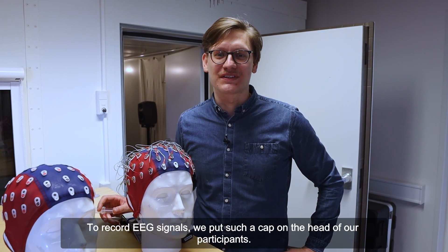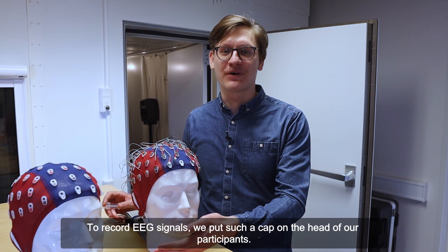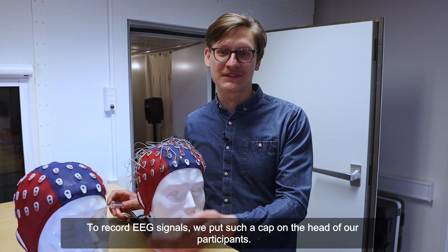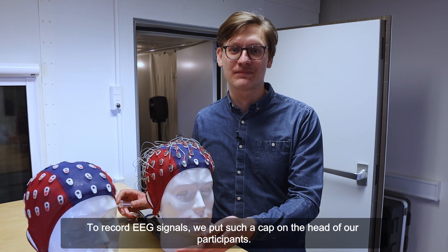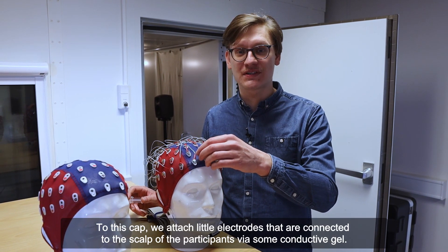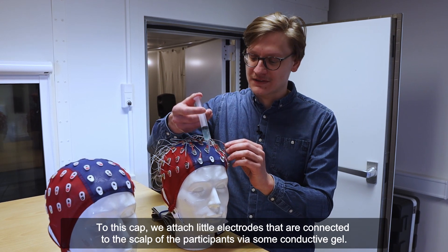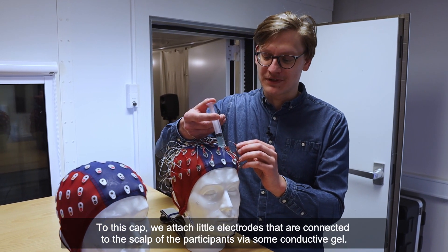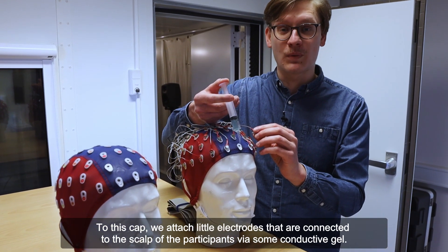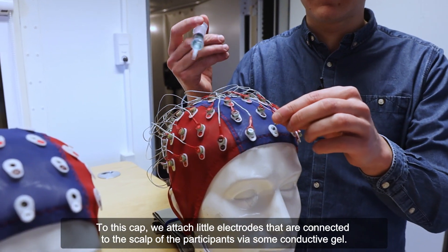To record EEG signals, we put such a cap on the head of our participants. To this cap, we attach little electrodes that are connected to the scalp of the participants via some conductive gel.